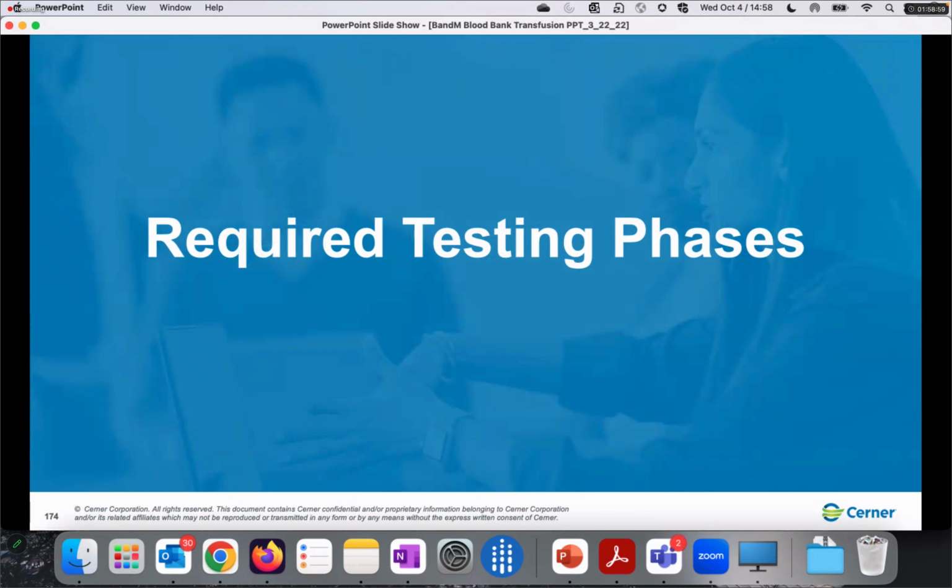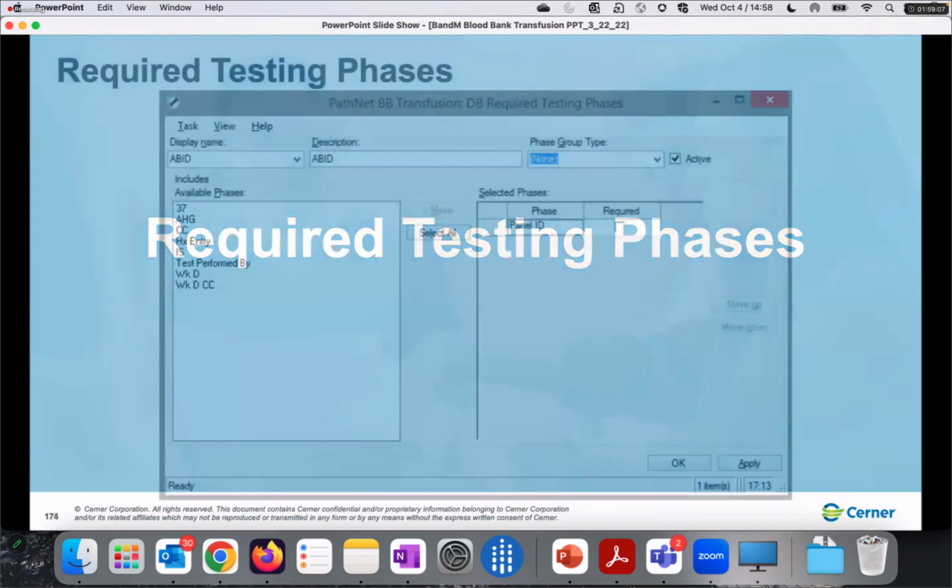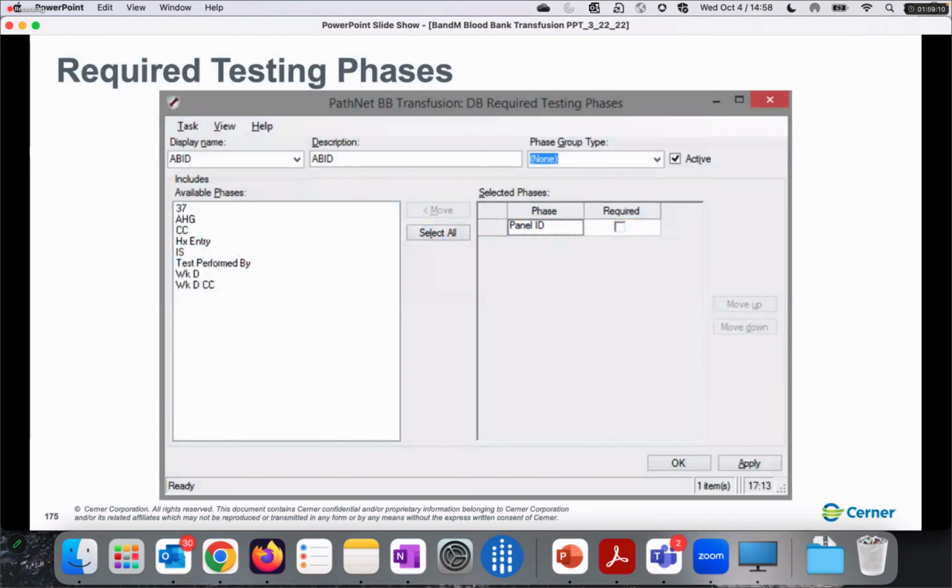The testing phases, kind of like those cells that we talked about, do have the potential to have different groups, where you could mix and match them for the purposes of different tests. Now, we don't really do that much anymore. Usually the testing phases are just associated directly to an order because each order will have certain conditions that it's tested under, and that's all we need.